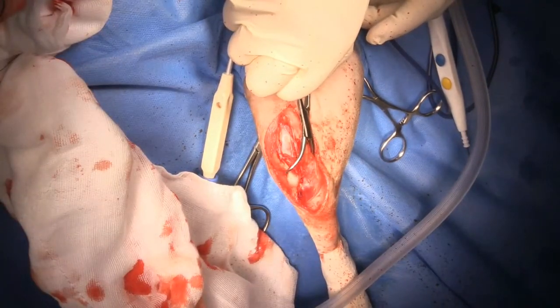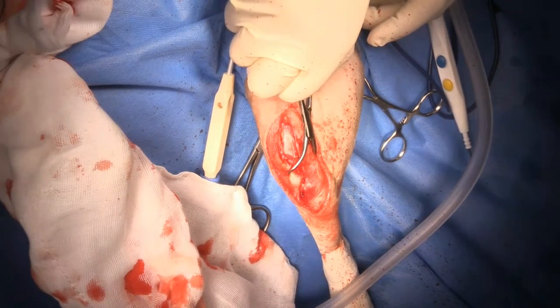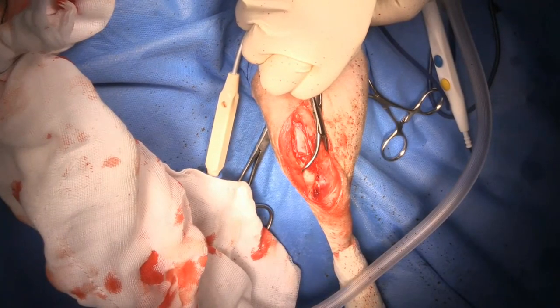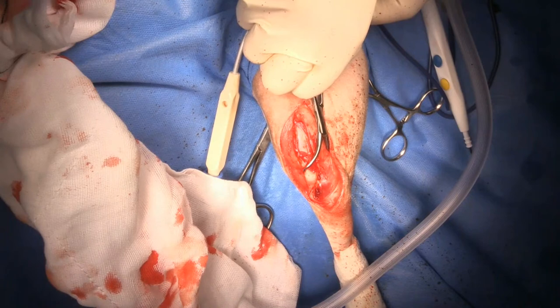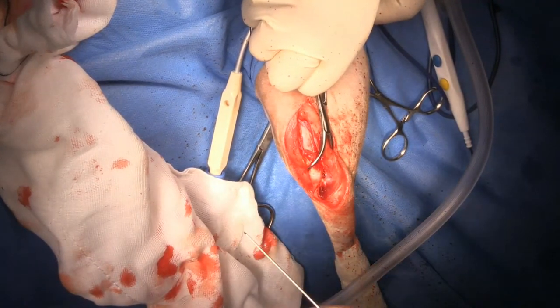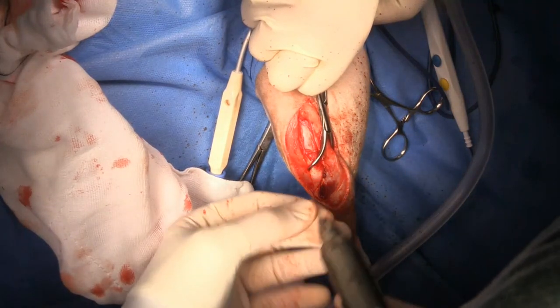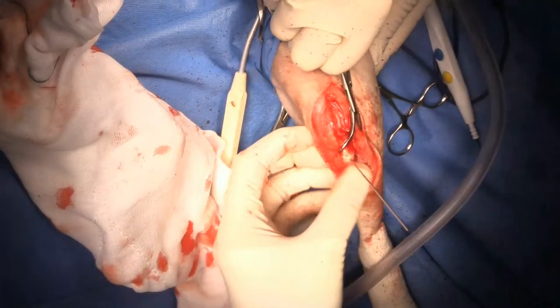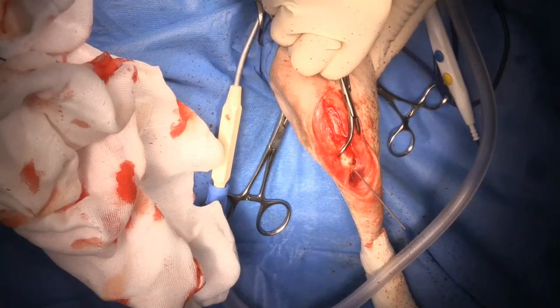I need some 0.054 inch pins. You want your pins to be maybe 10-15% of the width of the bone there. I want to make sure the pin is going perpendicular to the tibial shaft so I'm not going to go into the joint. I'm palpating the pin coming out caudally and then backing it off just a little bit.